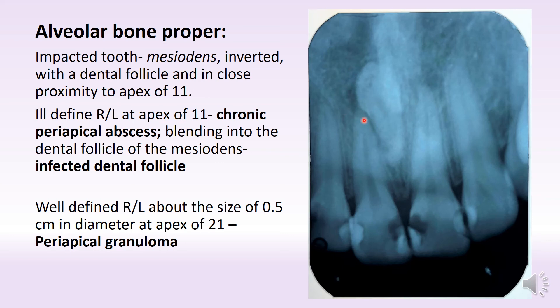What you definitely can see is that because of the loss of lamina dura and PDL at the apex of 1-1, there is an ill-defined radiolucency at the apex of 1-1, and this radiolucency is blending with the follicle of the impacted mesiodents.